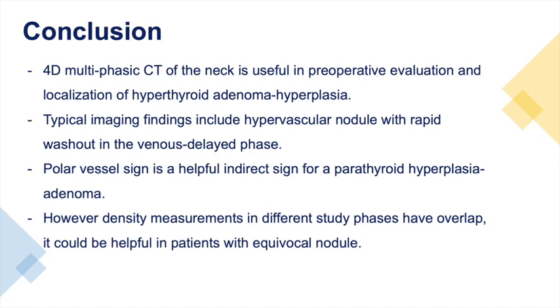The quantitative measurement of density or Hounsfield unit in different study phases have overlap between the lesions, but it could be helpful in patients with equivocal nodules.